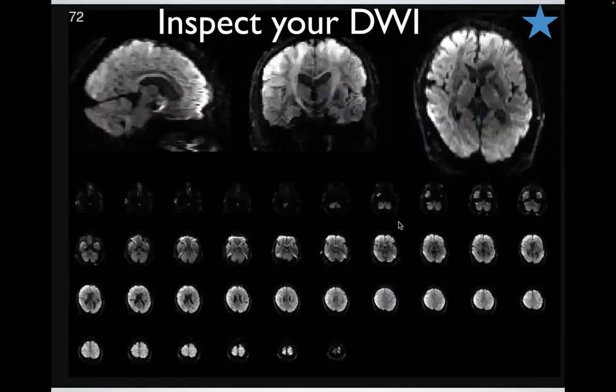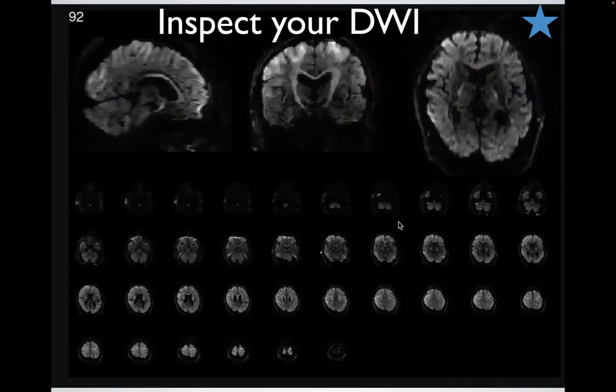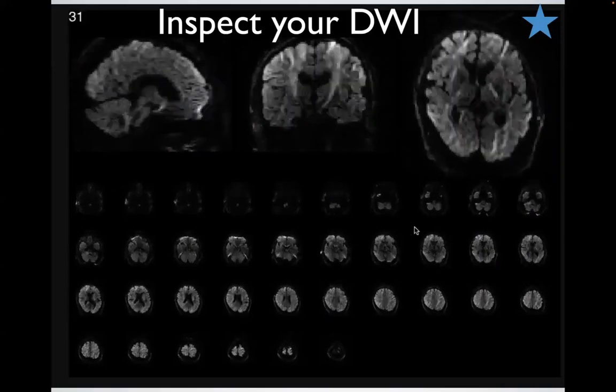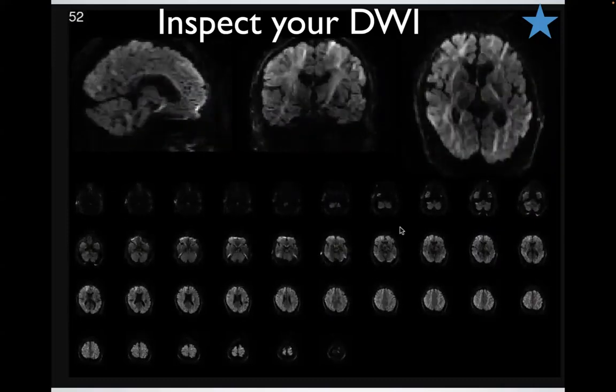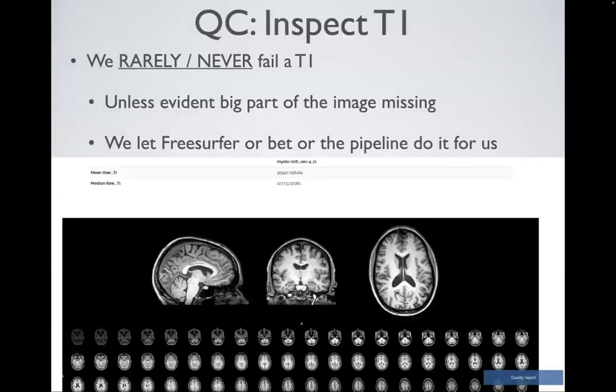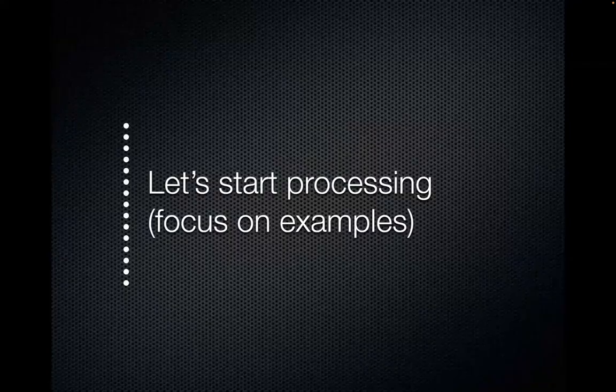In the era of the UK Biobank, where we have 50,000 such images, and the Human Connectome Project with thousands of images, I think it's important to do proper quality assurance. Same on the T1. T1 rarely fails, but I think it's also important to check your anatomical image.